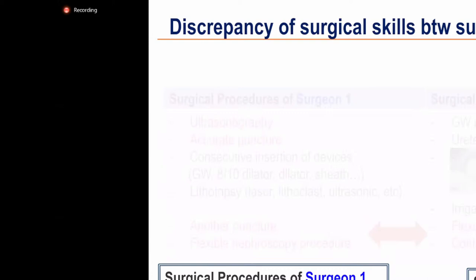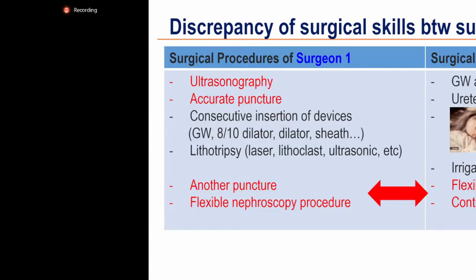So I organized them in order of time. If the second surgeon is not an expert, we have to find the most efficient way of performing combined surgery. Red color marks mean the procedures for an expert, and the rest of them can be applied to an expert and a beginner together. The time for lithotripsy is valuable to our residents or fellows, because they can sleep during this time, and it becomes sweeter to them when the stone is large.